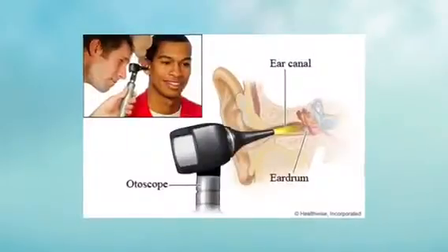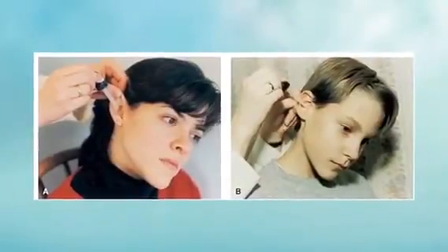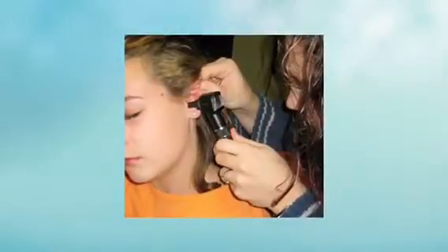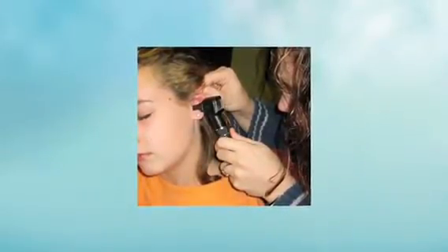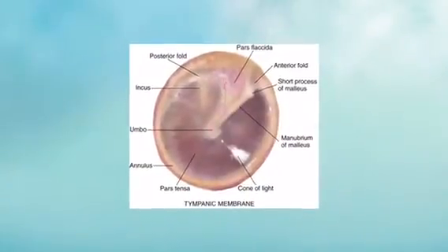Tilt the patient's head. Pull the pinna up and back. Pull the otoscope against the patient's head, handle up. Keeping your hand on the patient's face, gently insert the speculum into the patient's ear. View the tympanic membrane through the window.